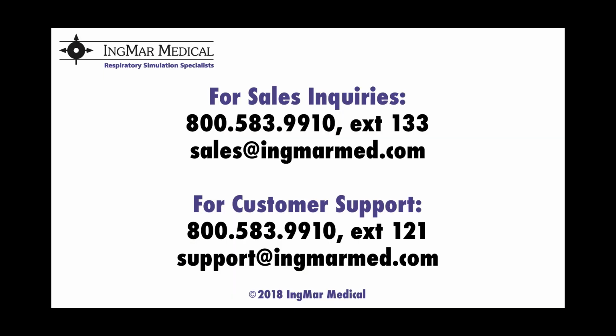So before calling, if you have an issue with your ASL 5000 hardware or with your ASL 5000 software, before calling into Ingmar Medical to help us funnel your issue, the best thing to do is to have your serial number of your unit ready, the software version that you're using, the connection type that you're using to connect to that ASL 5000, and a description of the issue. On this tile, you'll see the phone number of how to call in or the support number to email in.